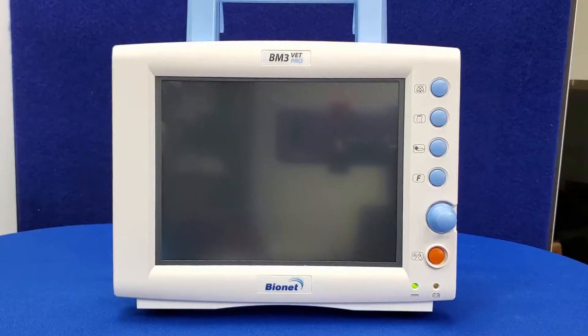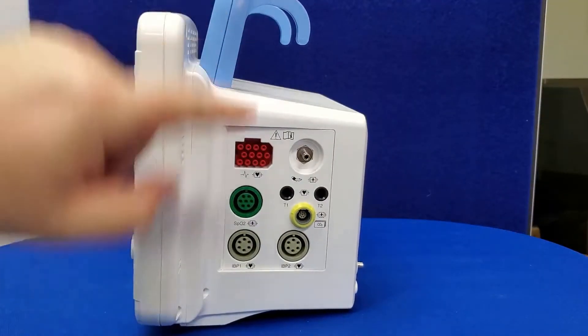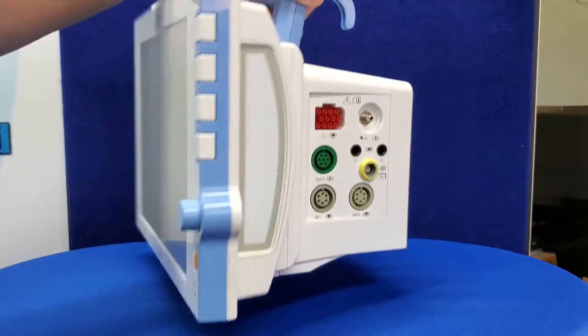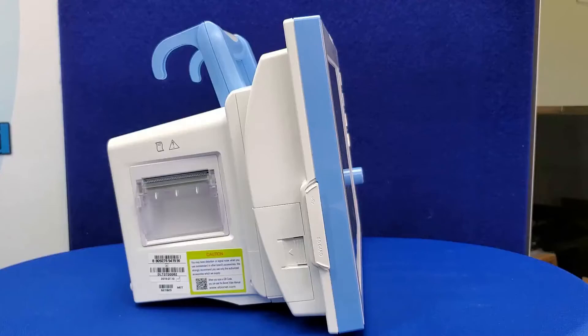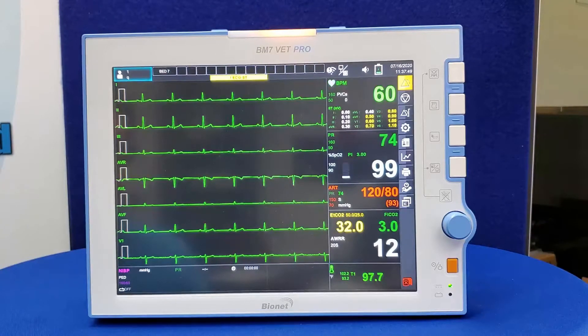Let's look at the differences between the three different models that make up the BMVet Pro series. The BM3 Vet Pro has an 8-inch screen and is designed to cover all the monitoring needs of a majority of veterinary clinics. The BM5 Vet Pro features a 10-inch screen and the addition of a second temperature port and two invasive blood pressure ports; the invasive blood pressure accessories are optional and do not come standard. Finally, the BM7 Vet Pro has a 12-inch screen, invasive blood pressure ports, an additional USB port, an SD card slot, and an expansion slot for an additional battery, bringing the operational battery time to four hours. Both the BM5 and BM7 Vet Pro can display full 7-channel ECG waveforms with an optional 5-lead ECG cable.